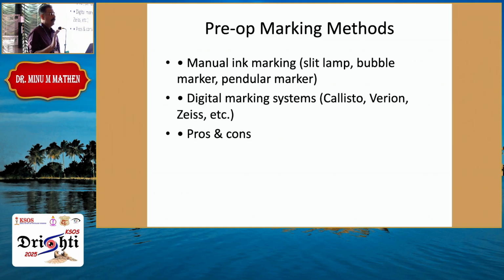So finally, you should come to a situation that you have identified a step which will give you the best results. So what I have identified is to make the patient sit at the slit lamp. I have tried this freehand marking, patient sitting in front of you and looking at you, and bubble and all those. Very difficult. Once you start becoming presbyopic, you have to lift your head like this, look through your glasses. You don't have to do it right now, but later you will also become presbyopic. And finally, you will have to use this and look at the patient like this.